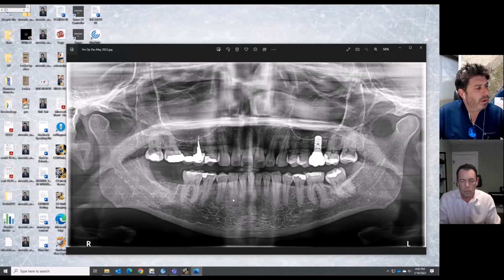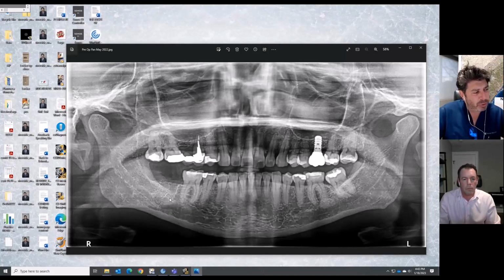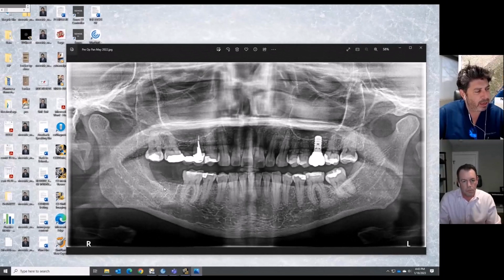So immediately post-operatively, after the extraction and bone graft is performed, I use allograft, which is a particulate cadaveric or human bone that is cancellous in nature, small particle size. I reconstitute it with sterile saline. We make sure we aggressively clean out the socket so that we have really good condensation of this bone. And then we place an amniotic chorionic membrane on top, a figure-8 chromic gut suture, and send the patient on their way. Immediately post-op, this is what the X-ray should look like.